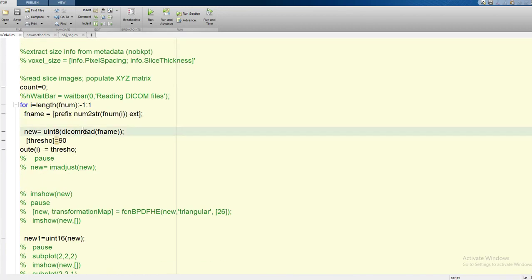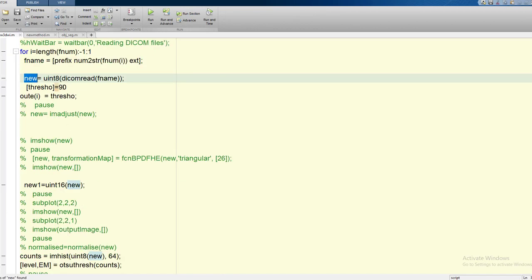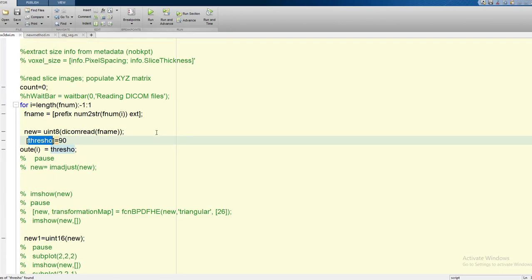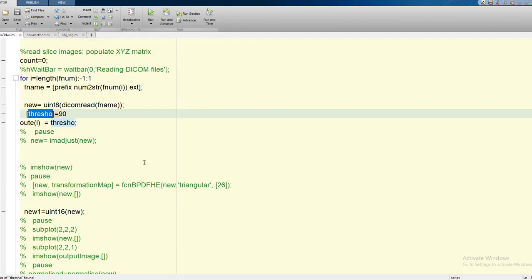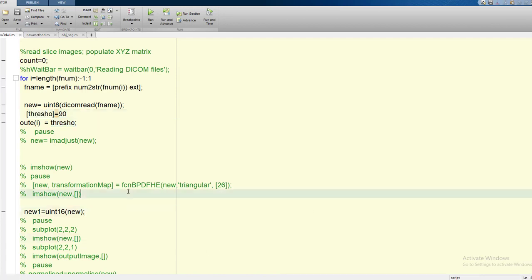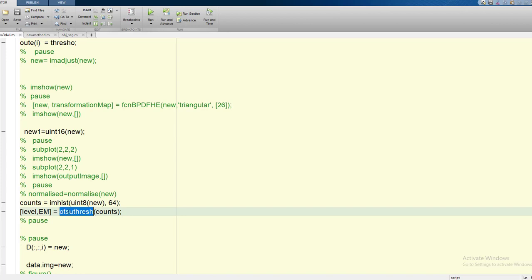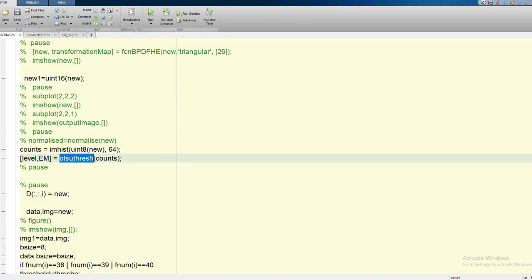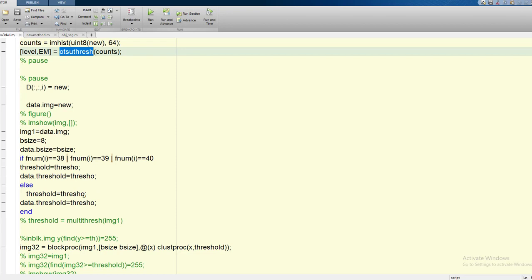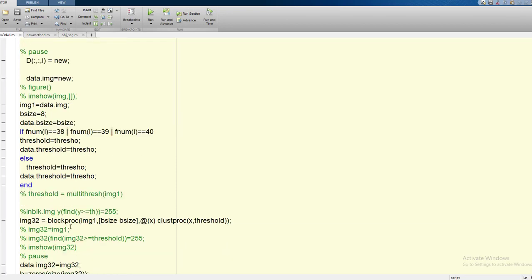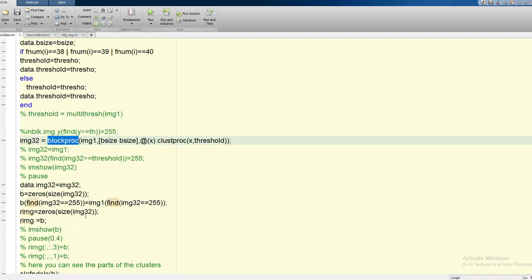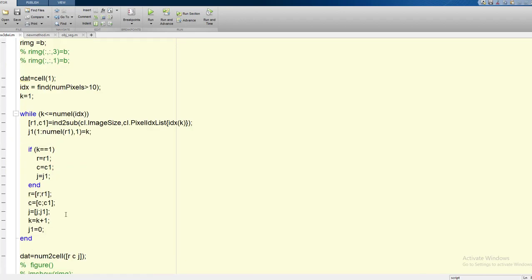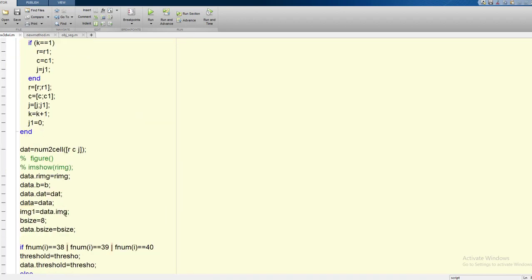Thereafter I will read all the DICOM images and put it into a variable. On that variable I apply some thresholding function so that I will be able to get an output corresponding to it. Then I calculate the histogram, apply Otsu thresholding which is quite famous for reducing noise, and get the binary output using block propagation where I can process each block. After processing the block, I'll be getting a segmented output which contains only the most dominating cells from the images.